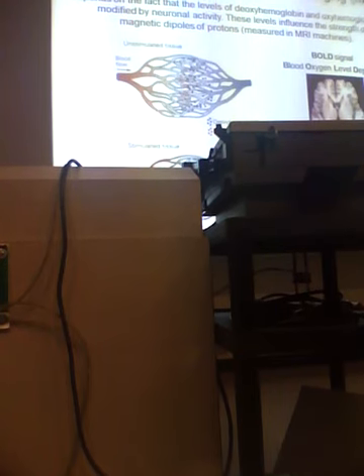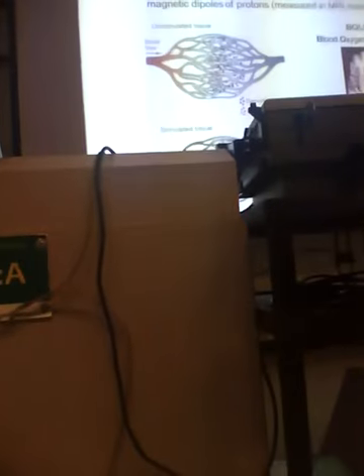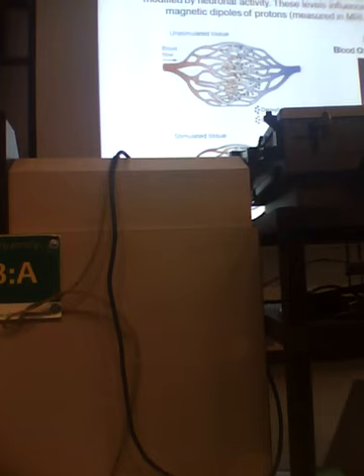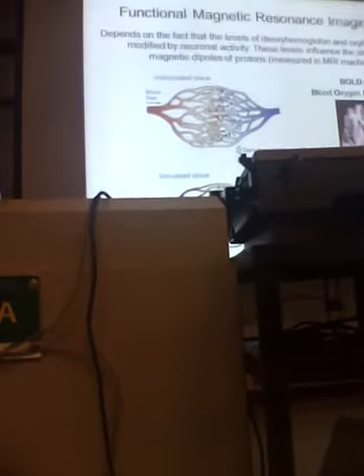So basically, get this straight, fMRI is not measuring directly the activity of nerve cells. It's measuring the activity indirectly by the changes in blood flow around the active neurons. So in fMRI, you're measuring blood flow changes, but those blood flow changes are produced by neuronal activity. The signal you get from this is often called the BOLD signal, which stands for blood oxygen level dependent. That makes sense because when things become active, you get more oxyhemoglobin.